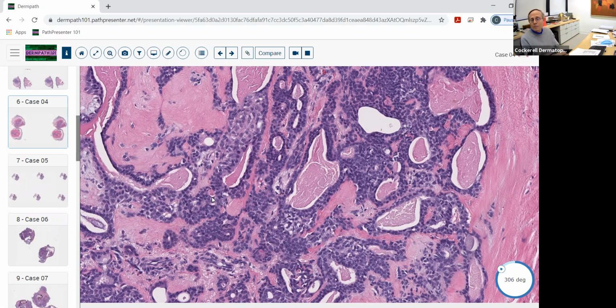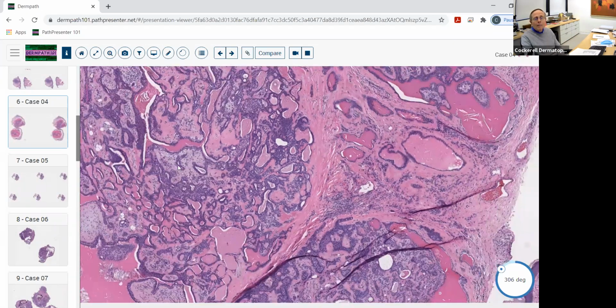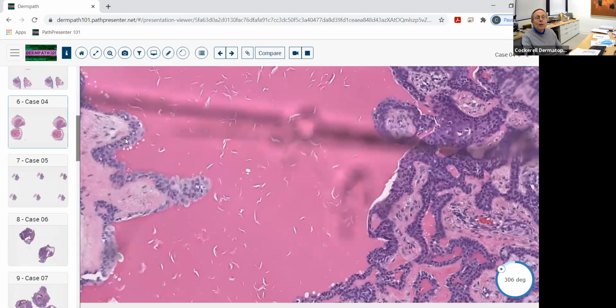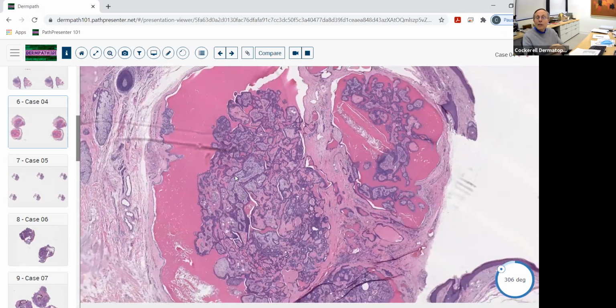And then if you want to worry yourself sick about giving it a name, you can think about some logical ways to name this. So it's basically got a cystic area to it. It's got this ductal papillomatous area to it. So I would probably call this a papillated apocrine... it's lined by apocrine differentiation in a number of areas over here. Cyst, because it's got a cystic component to it. Adenoma. Okay, so it's got the adenomatous component, it's got the apocrine hydrocystoma component to it, and it's papillated. So I would probably call this a papillated apocrine cystadenoma.